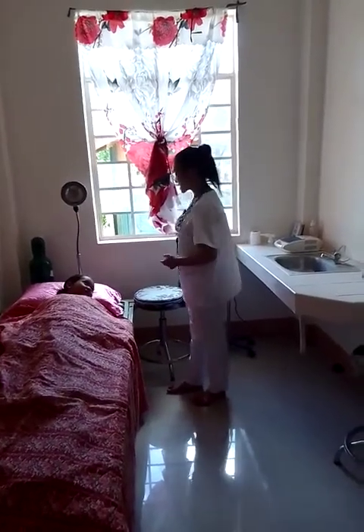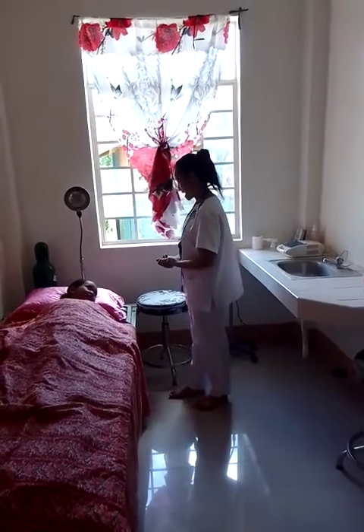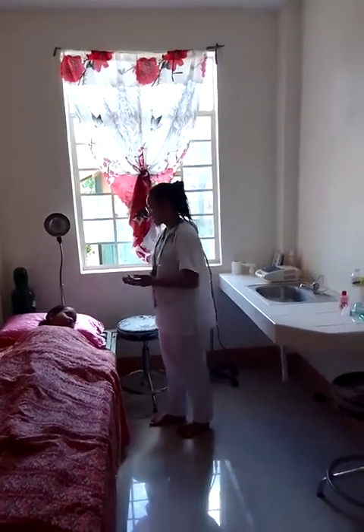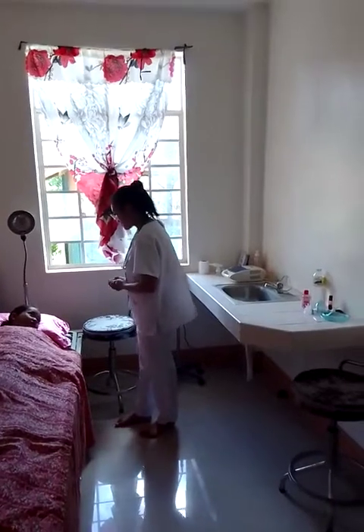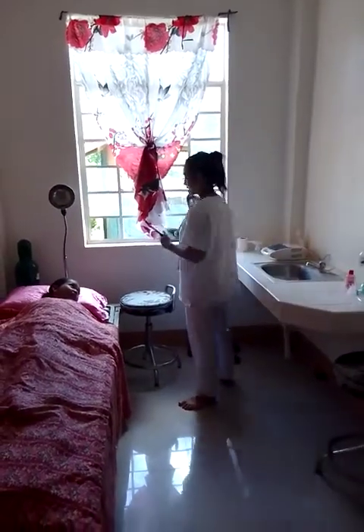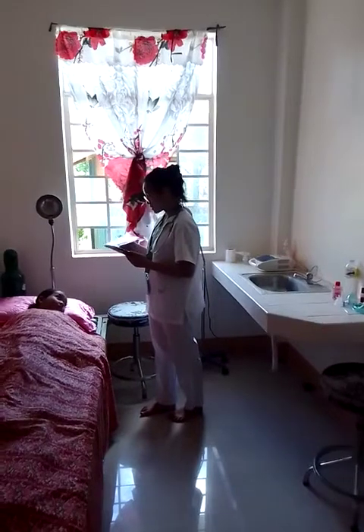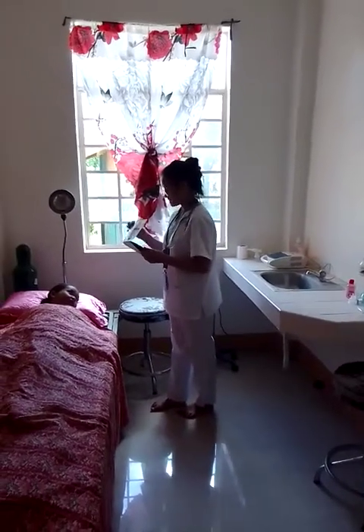Okay, I am Giselle, ma'am, and I am your nursing assistant for today. Today, ma'am, we will do nebulization. What is your name, ma'am? Bea. Okay. Your surname? Bea Jaime. Okay, Bea Jaime.